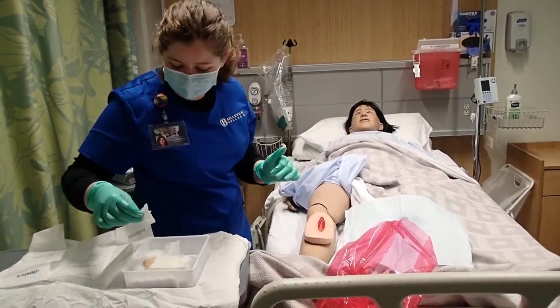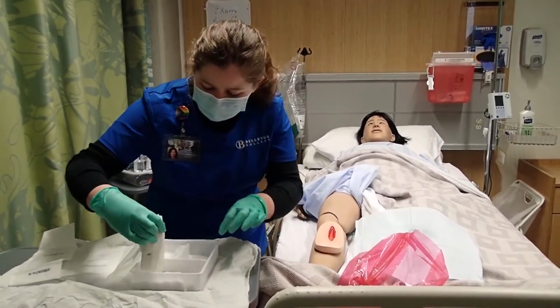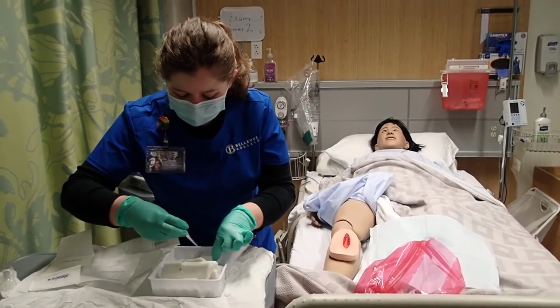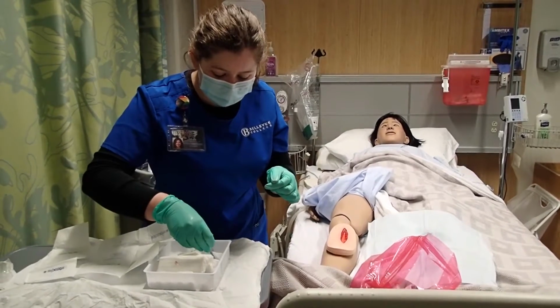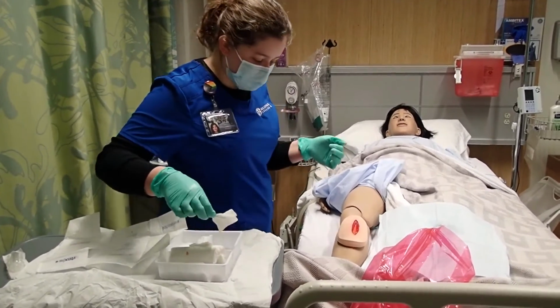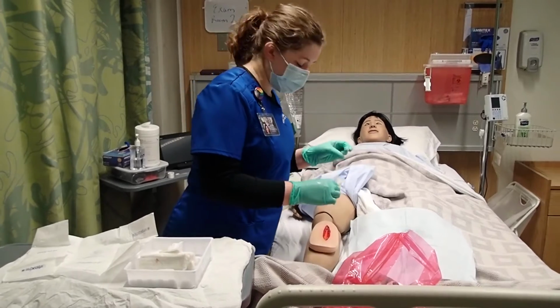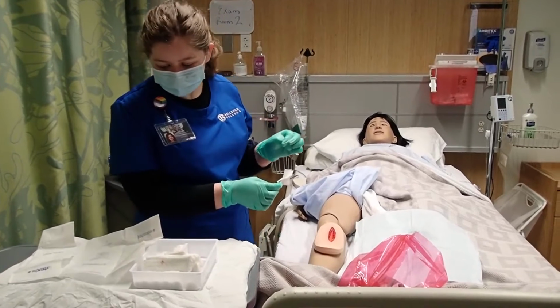And now at this point, okay, there we go. Just getting my supplies that I need. So now my gauze has been dipped into the saline. Now going from clean to dirty, I will cleanse the wound with the saline. Just ensuring I have all my steps.